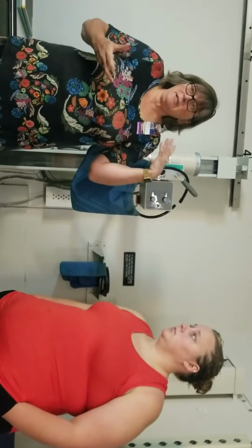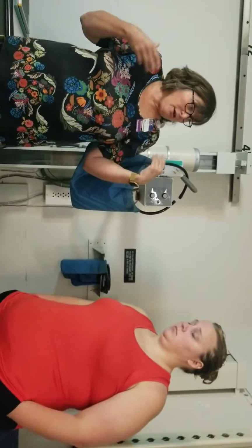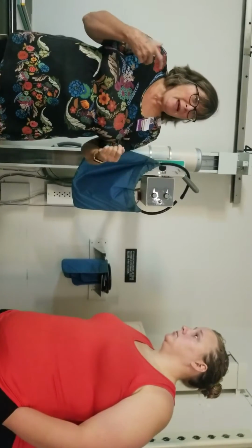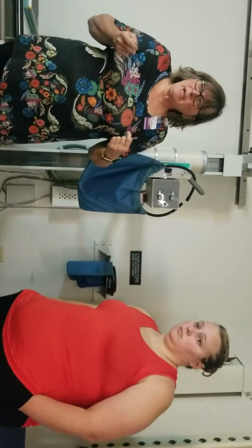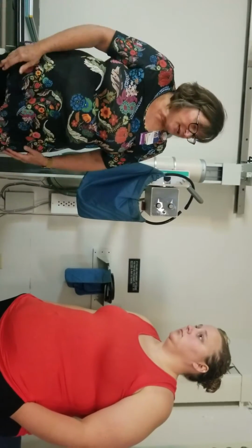I had a guy who was just in a t-shirt, or he's willing to take his shirt off, and he doesn't care if he doesn't have a t-shirt on. As long as I don't have buttons or snaps right in here, I'm good to go. Everybody good with that? Sometimes even some exercise bras, that thick strap will leave an artifact. Does that make sense, if they said, well, I don't have any snaps, but that thickness of the strap will leave an artifact. So we're going to pretend Ellen is all dressed.